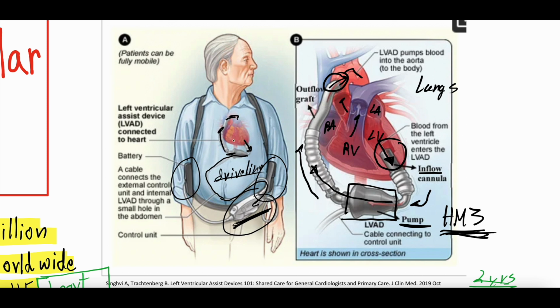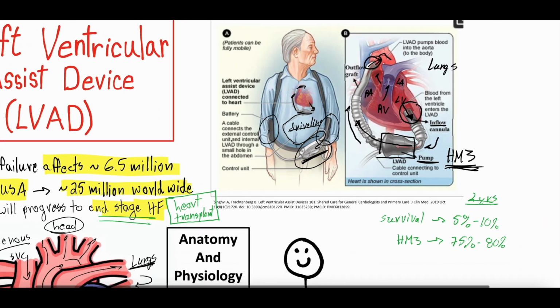So you can see that people with LVADs kind of walk around with all these things, but as compared to them just taking medical therapy and not surviving, this is, in many people's mind, a big upgrade, but certainly it's patient dependent. Obviously everyone has different preferences for how they're willing to live, but that's what the general structure looks like for people who have an LVAD, who are out in the world.